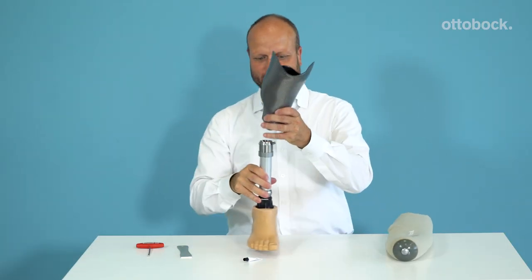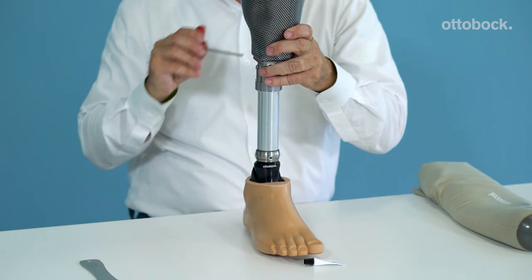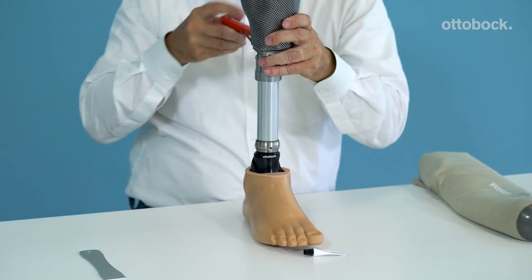The next step is to assemble the definitive prosthesis. Kai and I would like to thank you for your attention to this DVS video. We are very pleased that you took the time to accompany us and we wish you the best going forward with your DVS fittings.